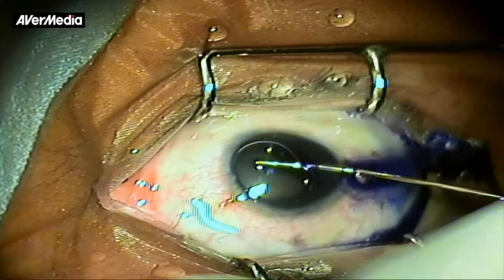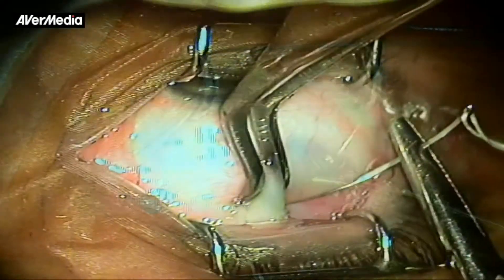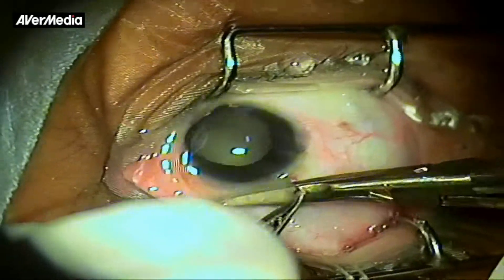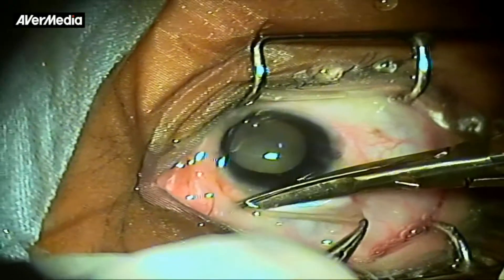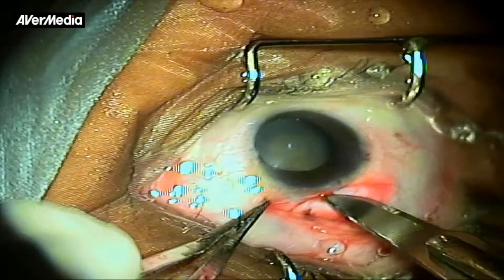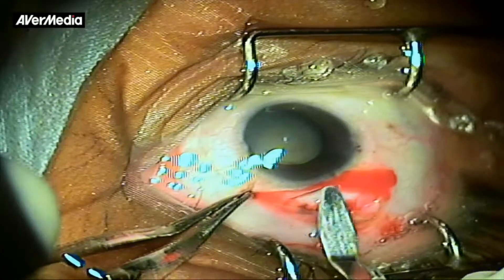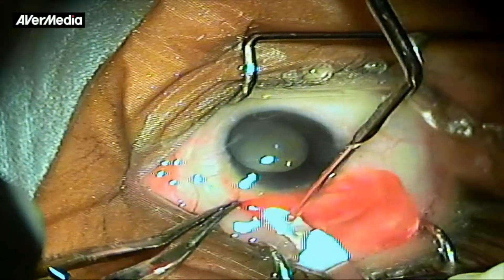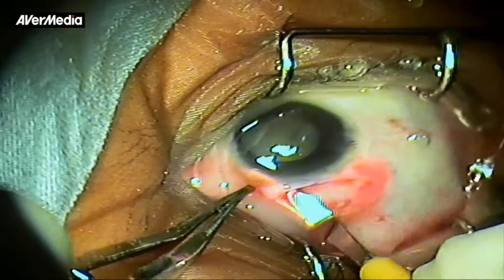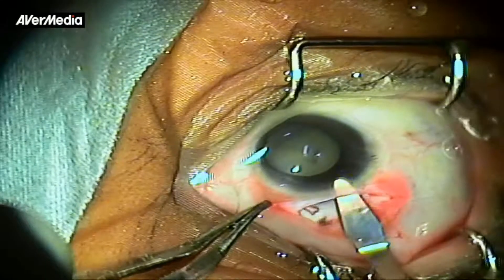The anterior capsule is stained with trypan blue. An important consideration is to determine which method of cataract surgery should be employed — Manual SICS is a good and safe technique to be chosen. While making the section, the incision should be at least equal to or a bit larger than the horizontal corneal diameter to ensure smooth nucleus delivery. Similarly, the scleral pocket dissection is more lateral and the internal lip is also wider than usual.